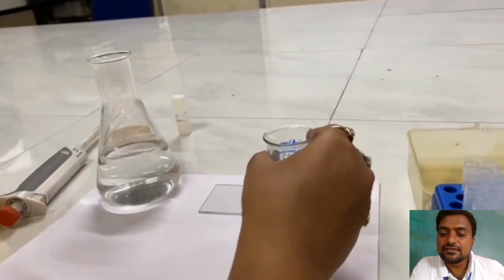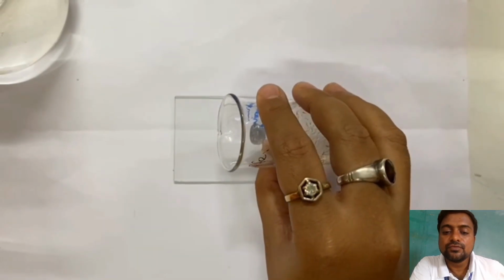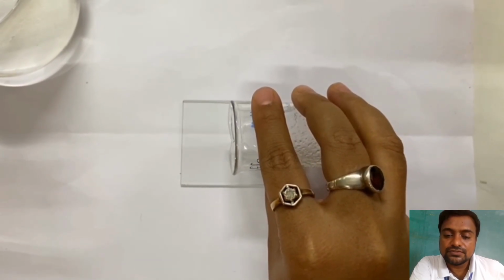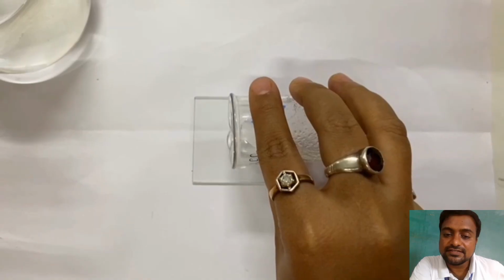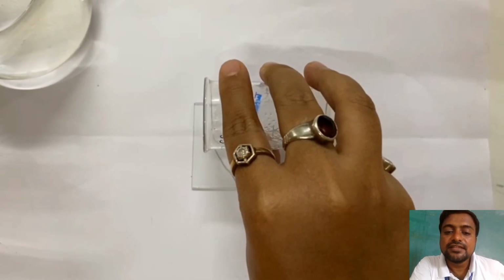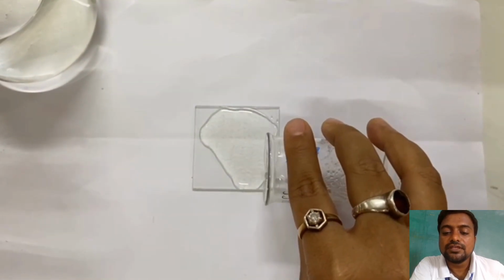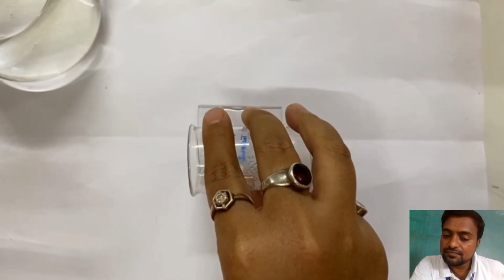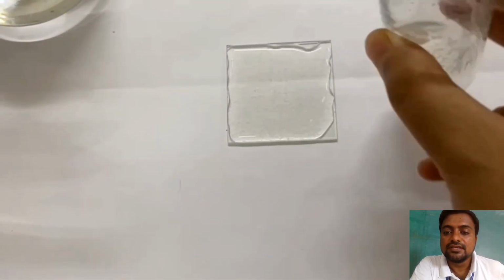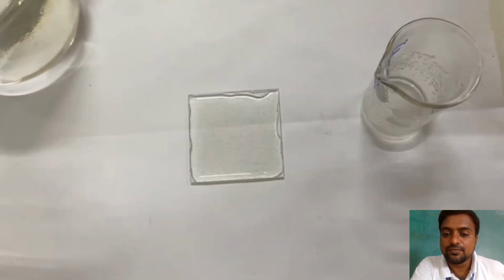Once the agarose has cooled, we take a glass slide and pour the agarose solution containing the antibody onto this glass slide in a nice fashion, so that we get a uniform piece of gel on the glass slide, which acts as a matrix or support.